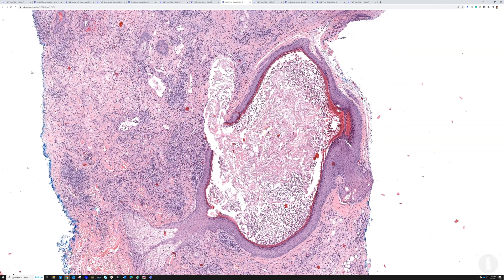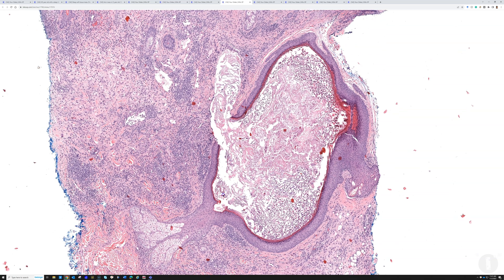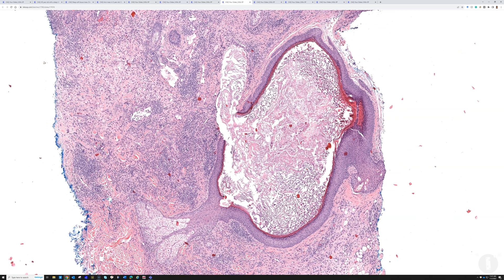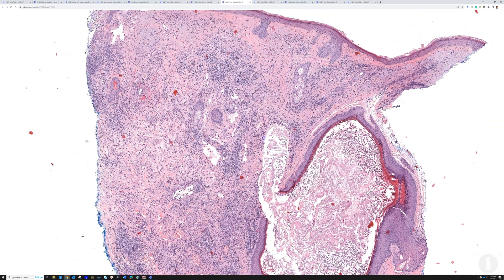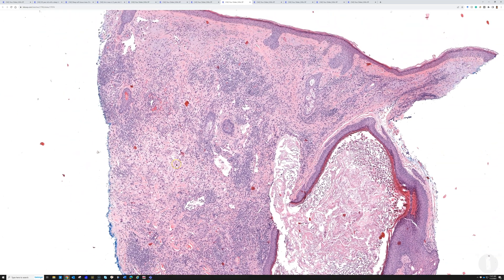They suspected a ruptured cyst clinically. Microscopically, we see an obvious cyst — or a cystic hair follicle, same thing — that has ruptured and spilled its keratin, and there's a bunch of inflammation around it.